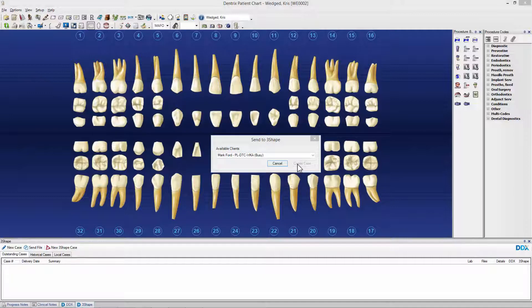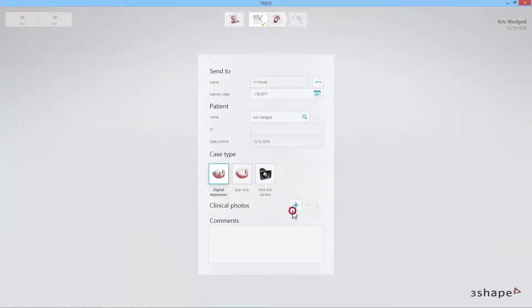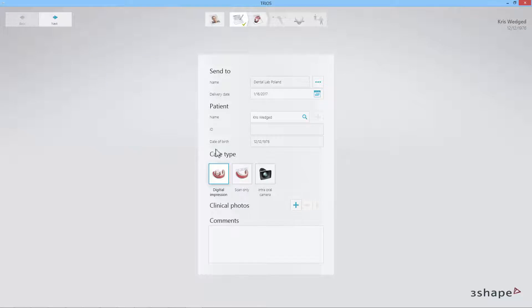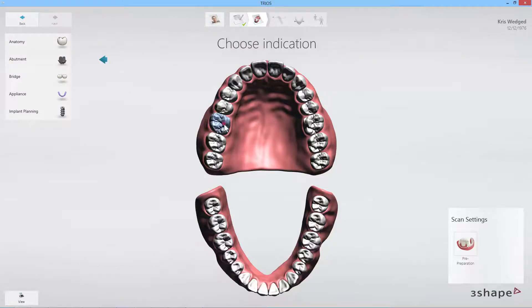Now go to your selected TRIOS scanner PC or cart. If the patient has been scanned before, the specific patient will be automatically selected and the patient's information will be added to the order form. If the patient has never been scanned before, the patient data from Dentrix will be transferred automatically. Either way, all you need to do is specify the details in the order form.